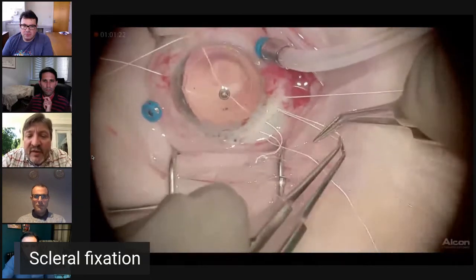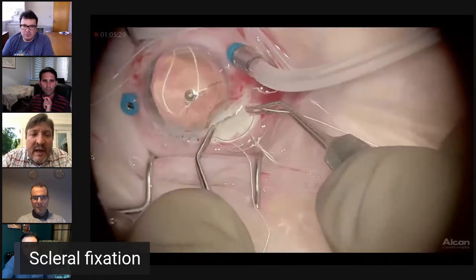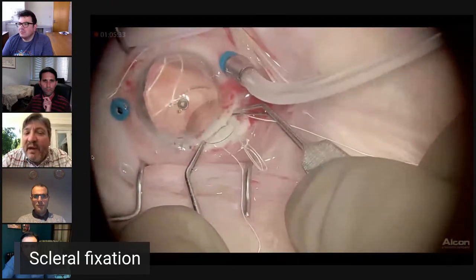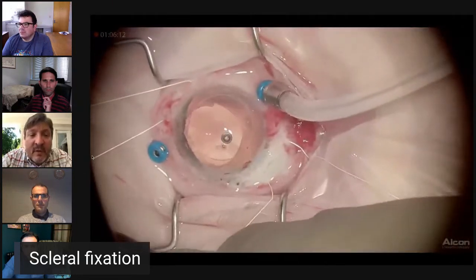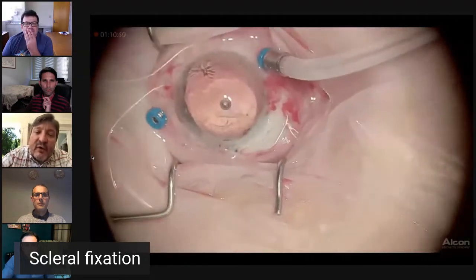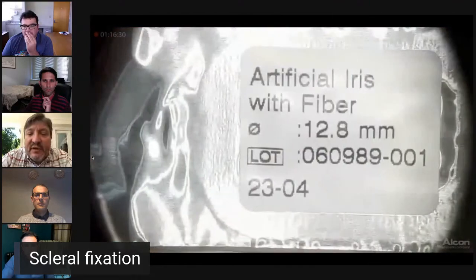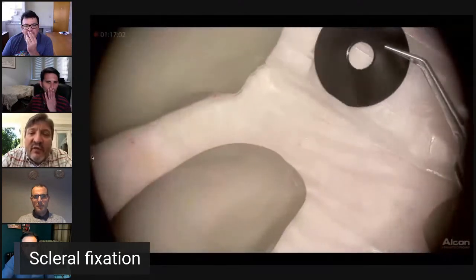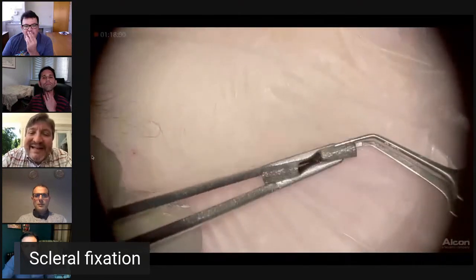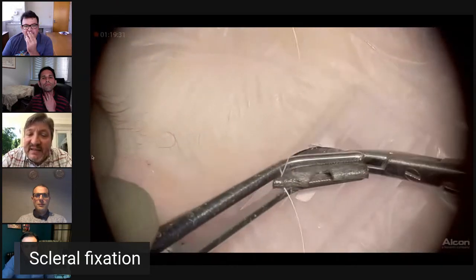We put our girth hitch around the IOL haptics. We put the IOL into the eye, and here I could have made my wound a little bit larger. And I'm speeding this up here again to show we rotate as far counterclockwise as we can, tie it, rotate the suture knots internally, and this is the artificial iris, okay? So I measured the anterior chamber and determined that I did not have to trephine this artificial iris. It would fit just fine in the sulcus.